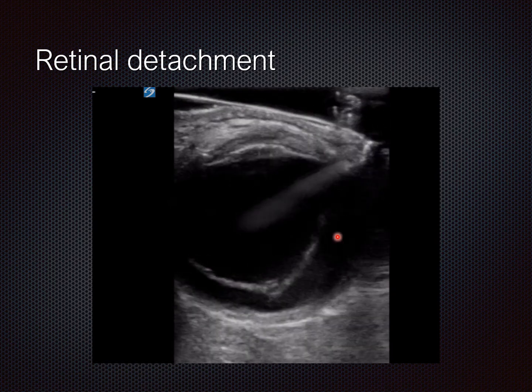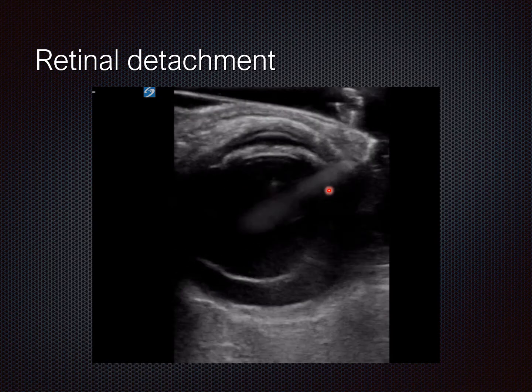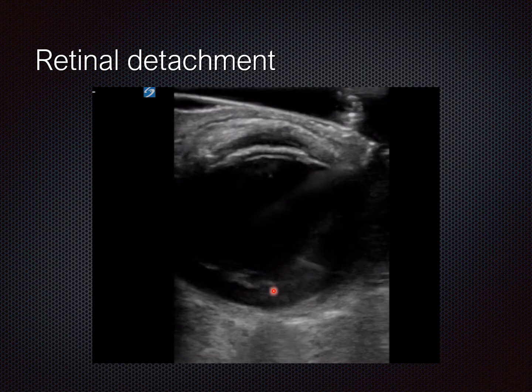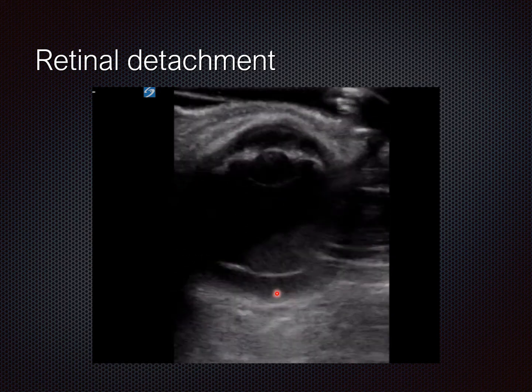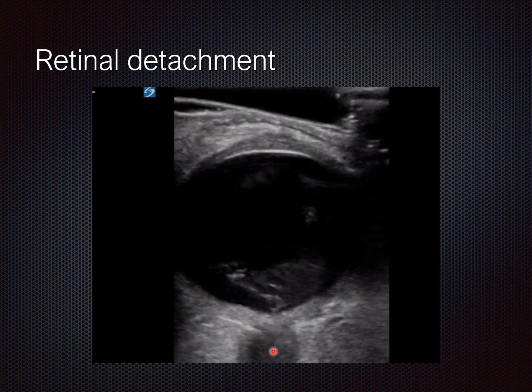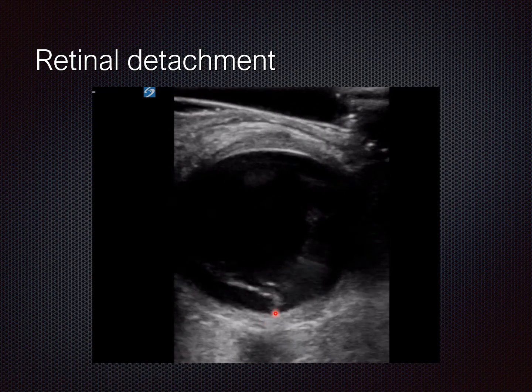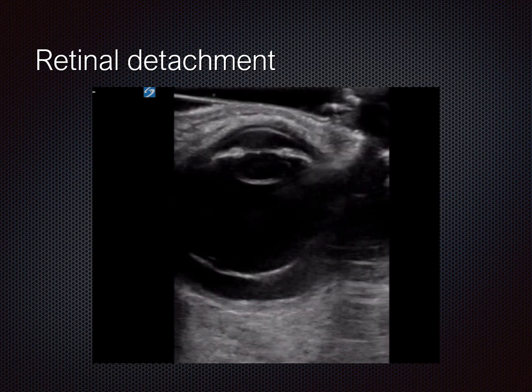And the reason I say that's important is because in a second we're going to talk about vitreous detachment, and because the retina is really just an extension of the optic nerve, all retinal detachments will not cross the midline. They will anchor at some point, either in the middle or earlier, because they have to feed down into the optic nerve. So this is a tricky retinal detachment because it's actually on both sides of the optic nerve, but because you can see that it's tethered here to the optic nerve, that's how you know that this is a retinal detachment and not a vitreous detachment.